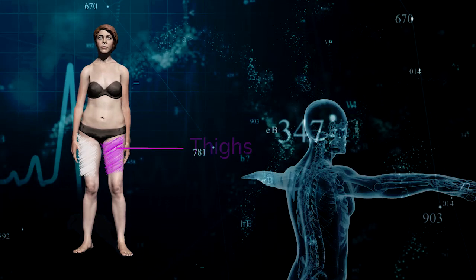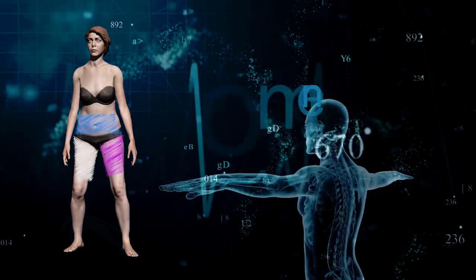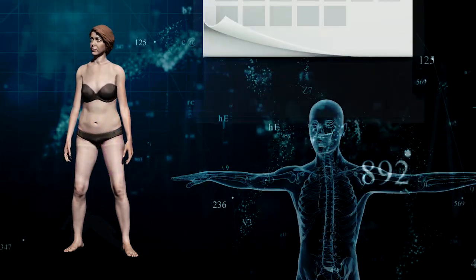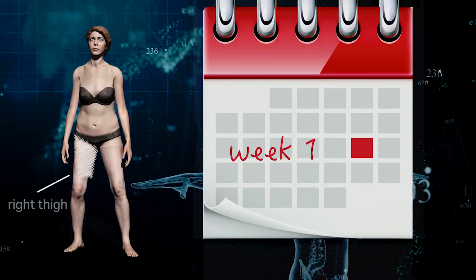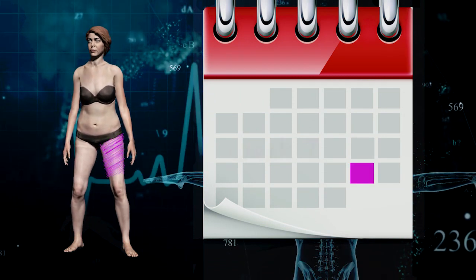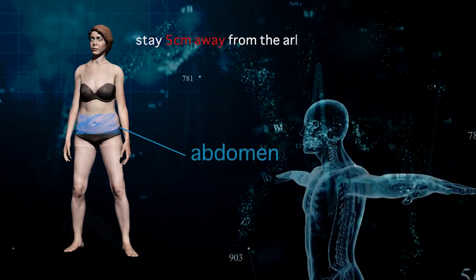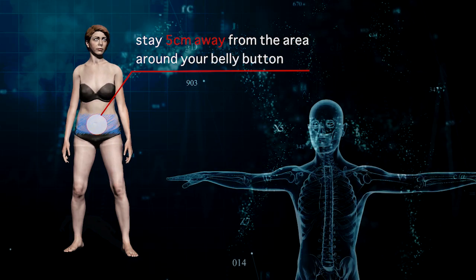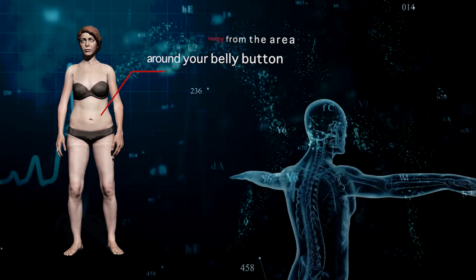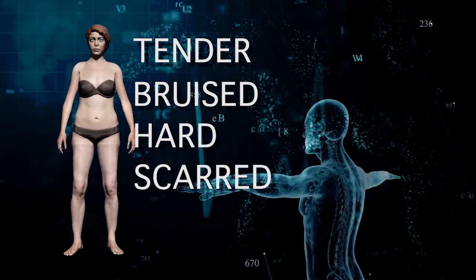The injection can be given in the thigh or abdomen, and it's best to choose a different site for each injection. So this week you might inject into your right thigh and next week your left thigh. If you are injecting into your abdomen, stay at least 5cm away from the area around your belly button. Don't inject into any area that is tender, bruised, hard, scarred, or red.